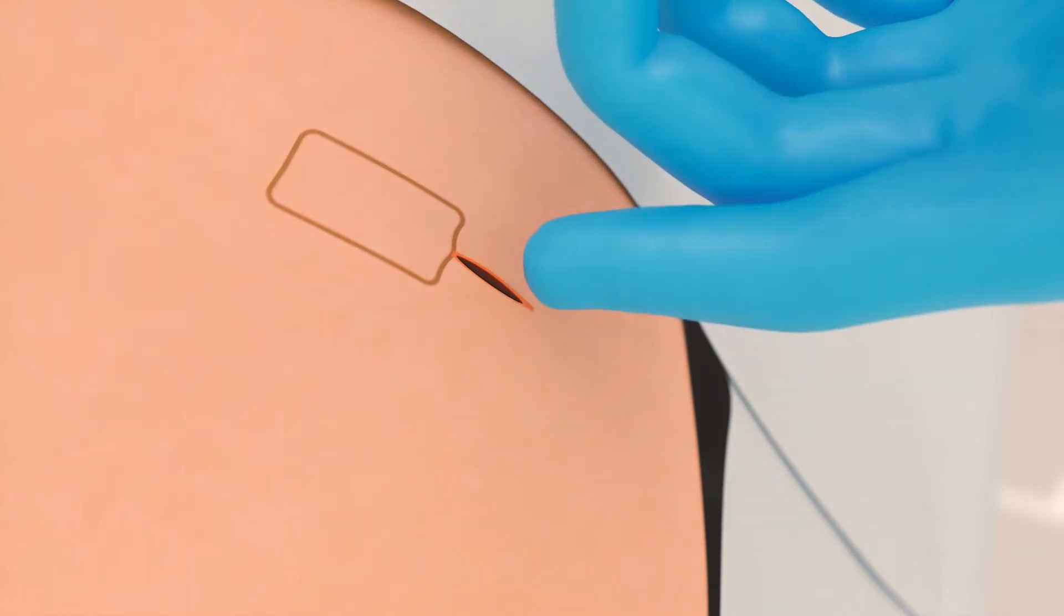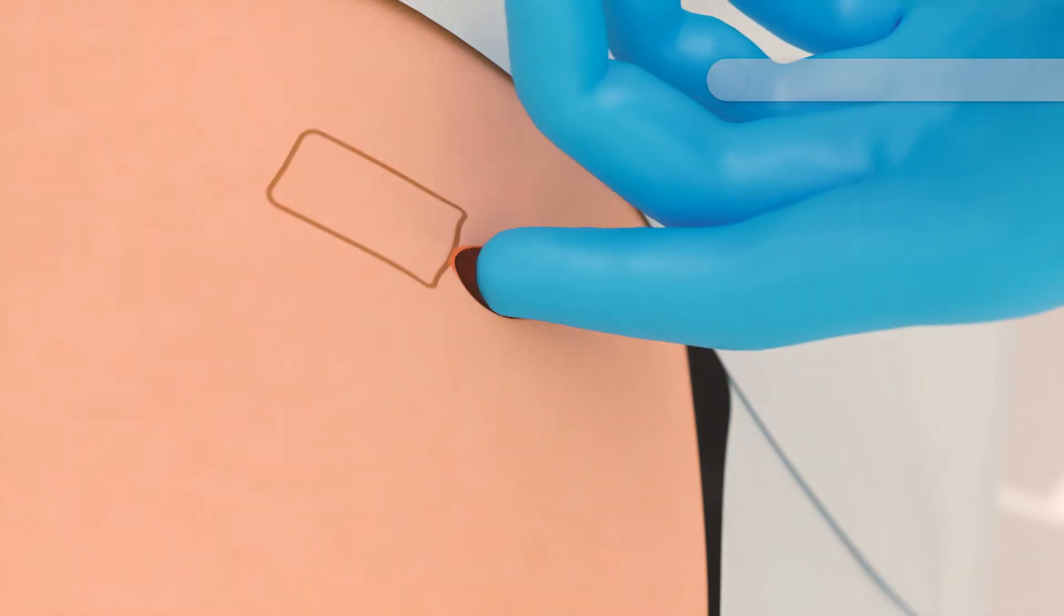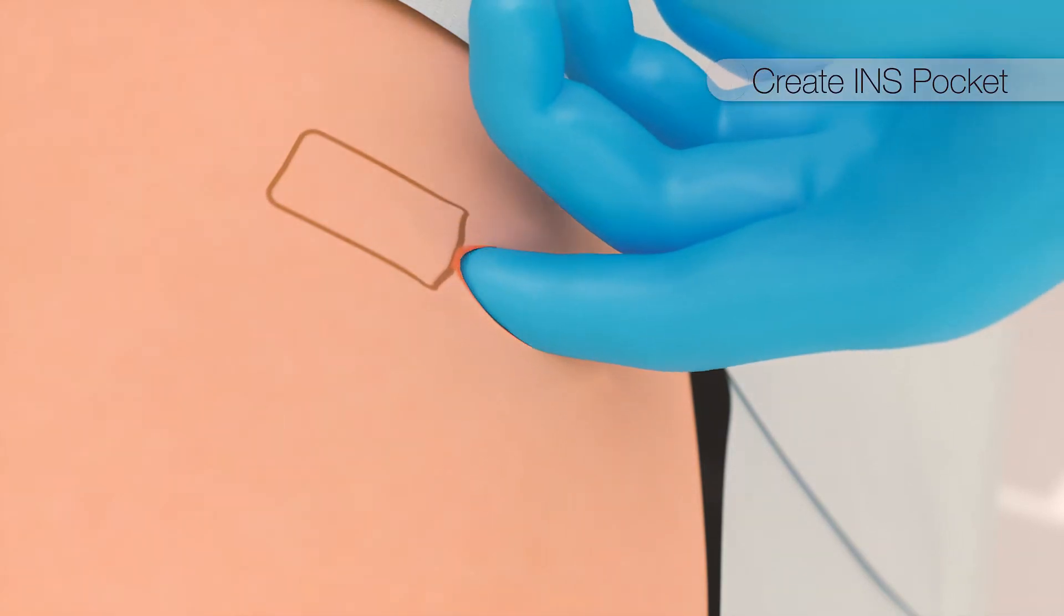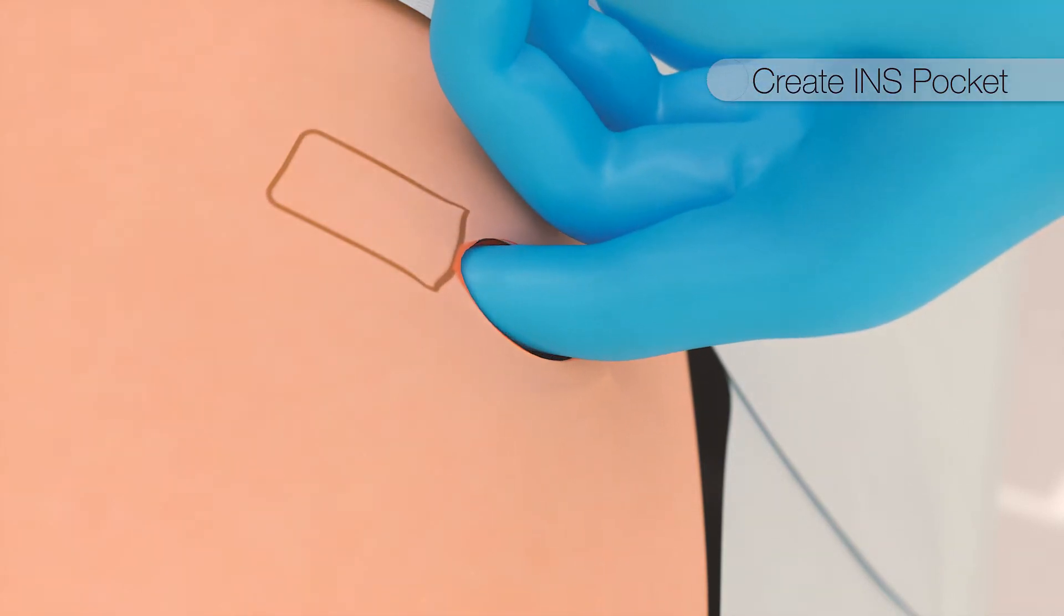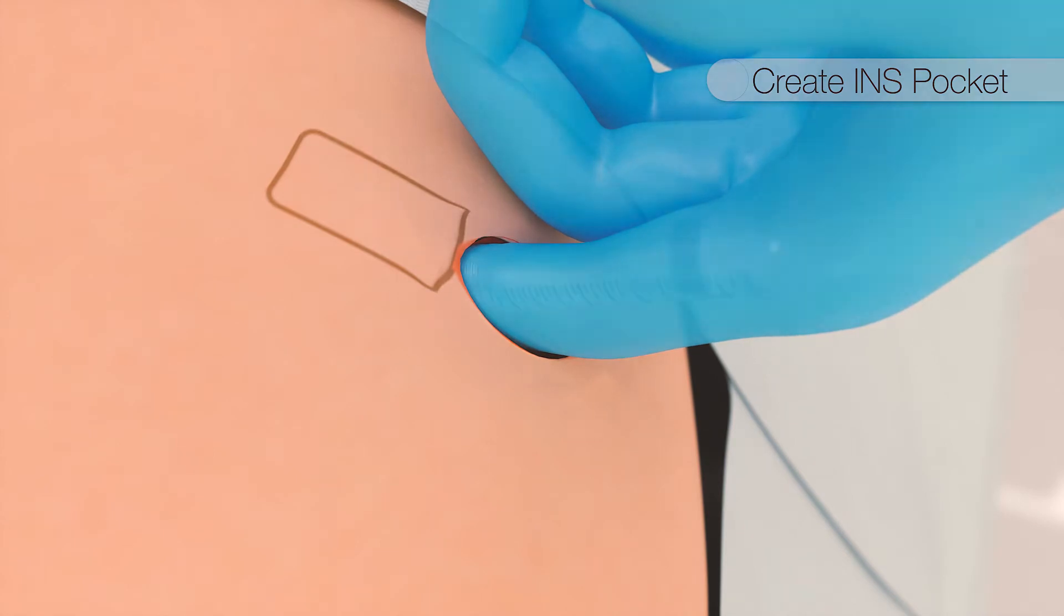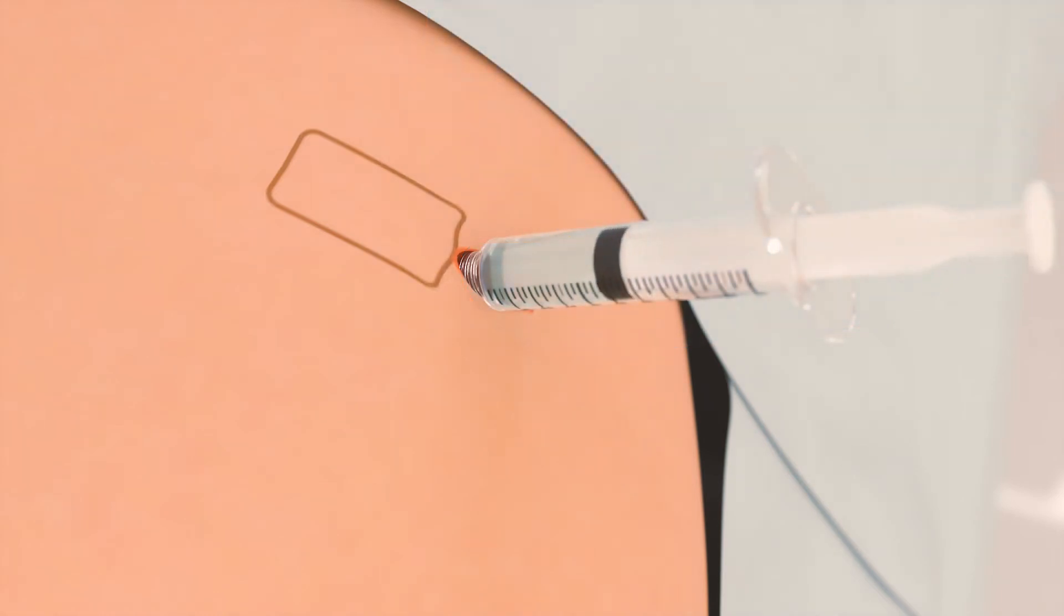After the stimulator incision is created, a pocket is created medial to the incision using blunt dissection techniques at a recommended depth of less than two centimeters. Hemostasis is confirmed and the pocket is irrigated.